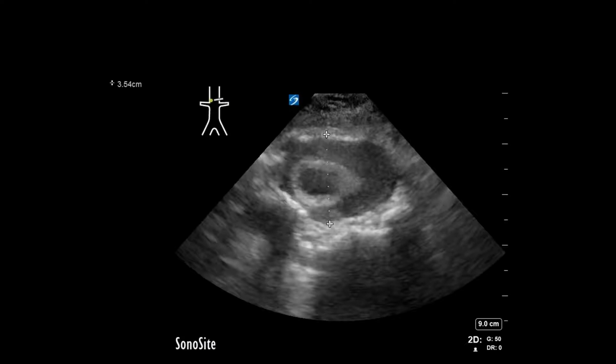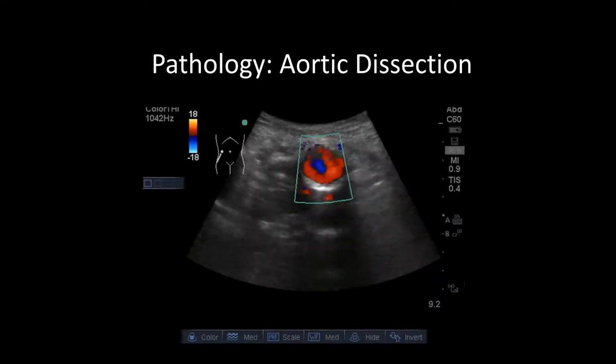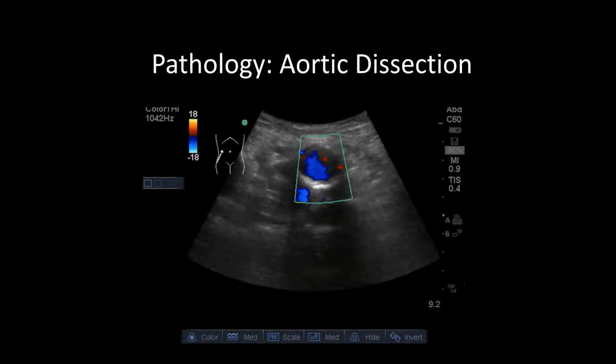Here's what we were talking about before. Note that the aorta is very abnormal in this view. However, if one got confused and measured just the inner diameter, you would grossly underestimate the size of this pathologic aorta. There's a nice hypoechoic clot in the wall.